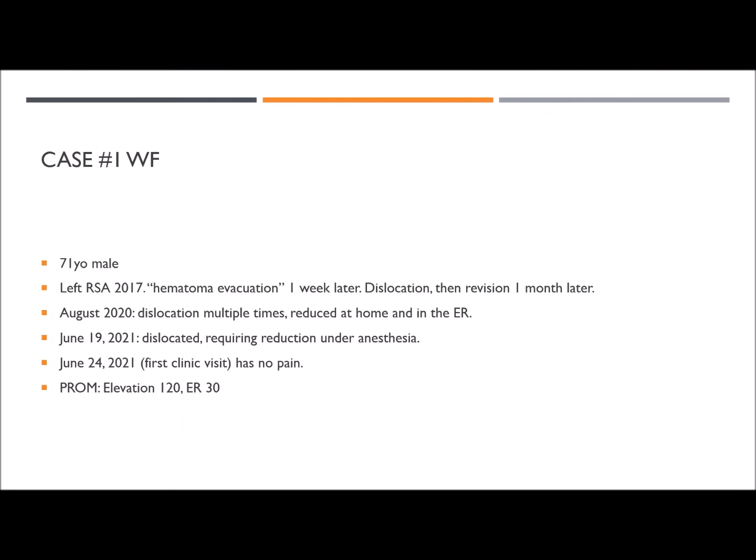I've had a lot of patients who've lost external rotation, lost range of motion. They've tightened up because of fixing these subscapularis tendons. But you have to do that with the Grammont design to maintain the stability. At least that's the recommendation.